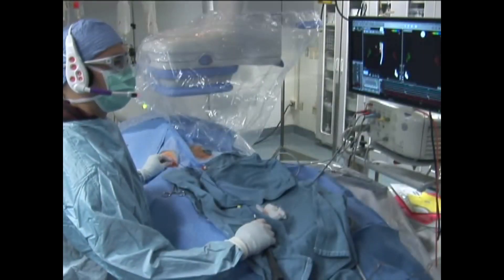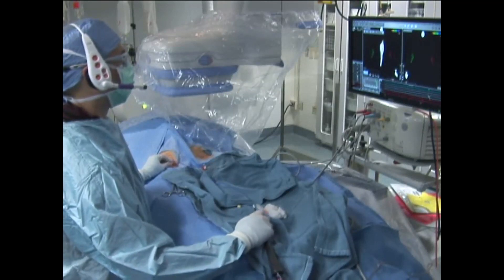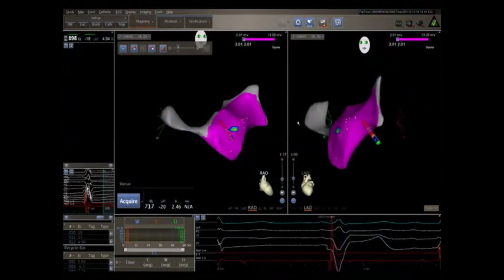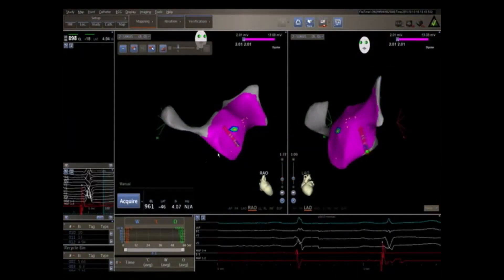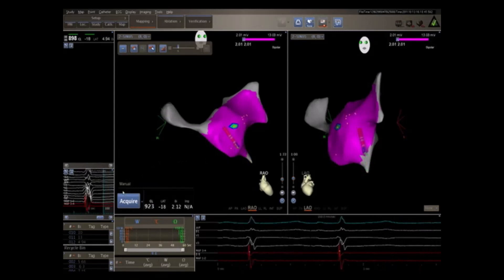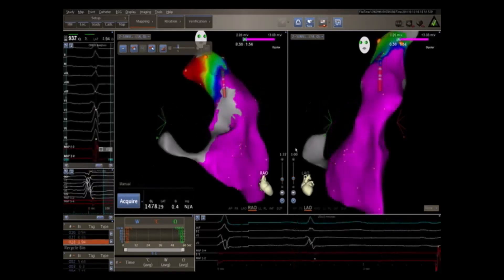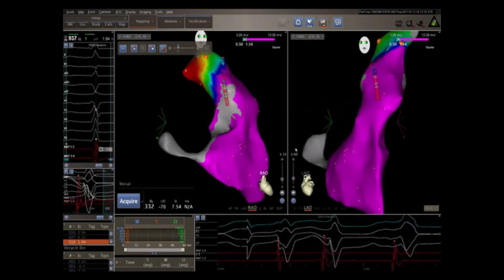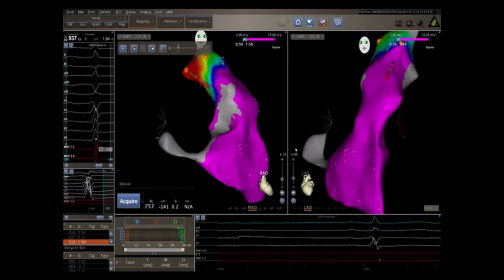Catheter placement is monitored using fluoroscopy or with a three-dimensional mapping system. The ablation catheter is advanced into the right ventricle and a three-dimensional anatomic and voltage map is made. The right ventricular outflow tract tilts leftward toward the left ventricle on the LAO view screen seen in the right video.